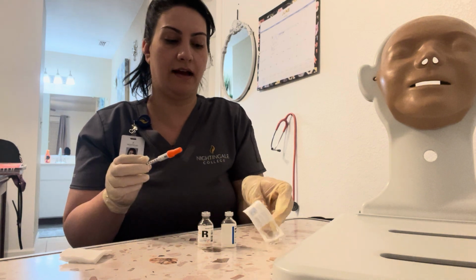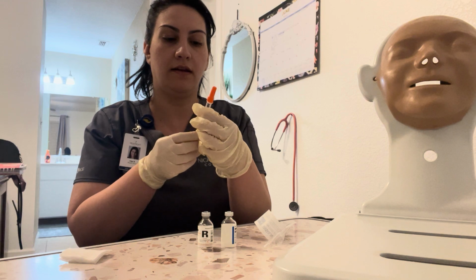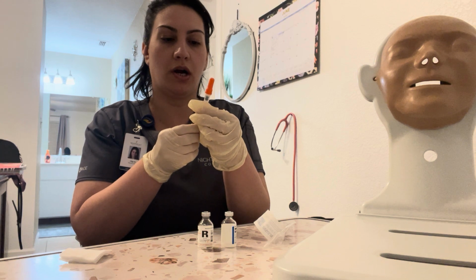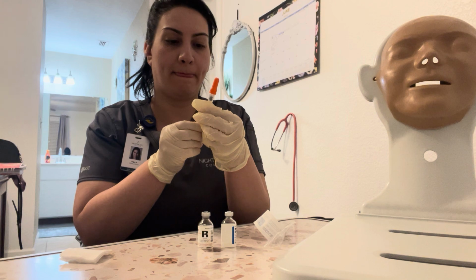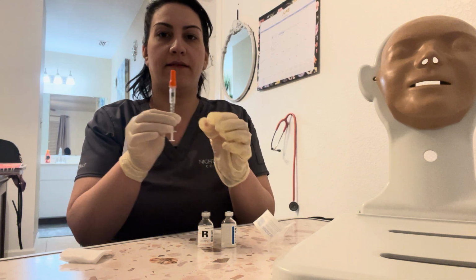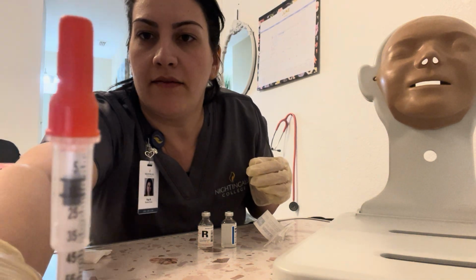So first we're going to get 8 units of air for the NPH. Nurse and I verify 8 units of air.